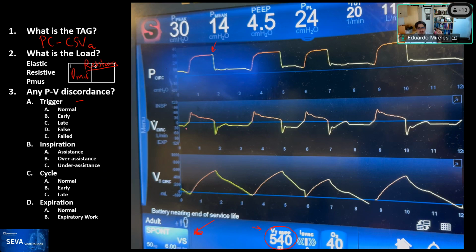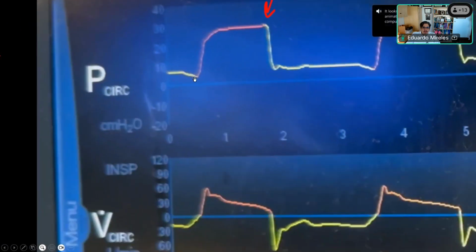Really good case, Samir. Challenging, I can imagine, especially because the triggering with the technology is going to be very hard to achieve. Do you have an outcome on this patient? Yeah.